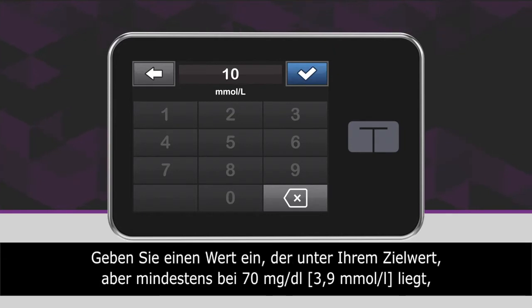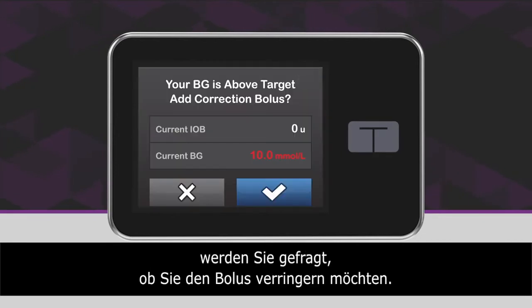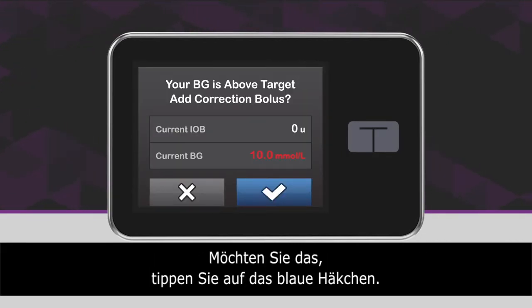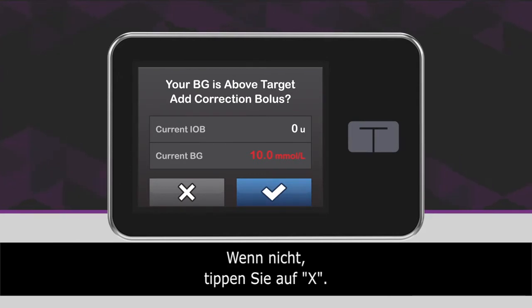If you enter a value that is below your target but equal to or above 3.9 millimoles per liter, you will be offered the option to reduce the bolus amount. To accept that reduction, tap the blue checkmark icon. Otherwise, tap the X icon.